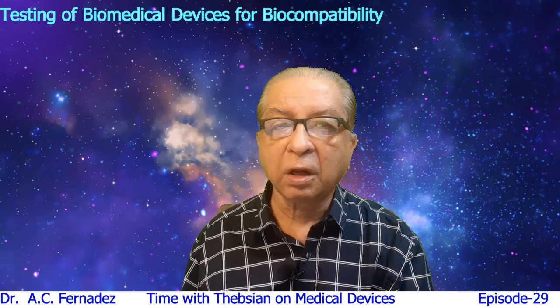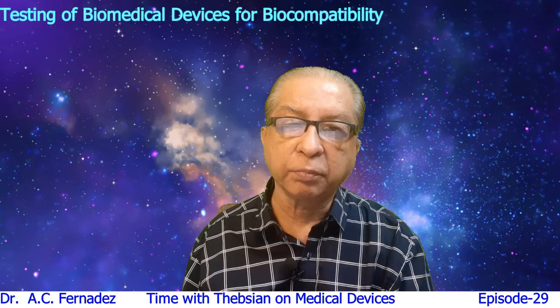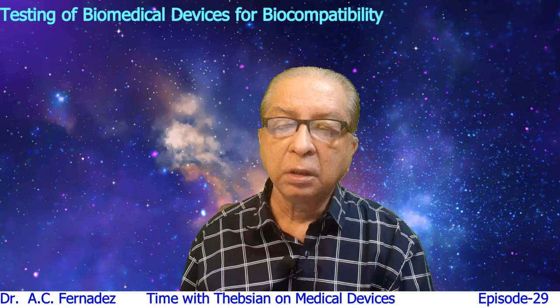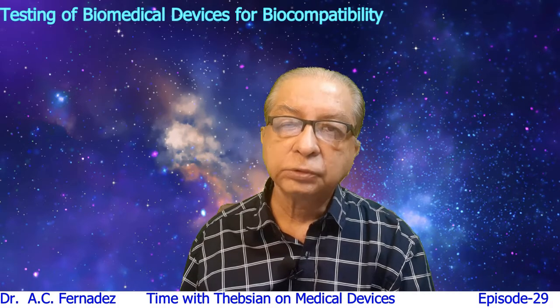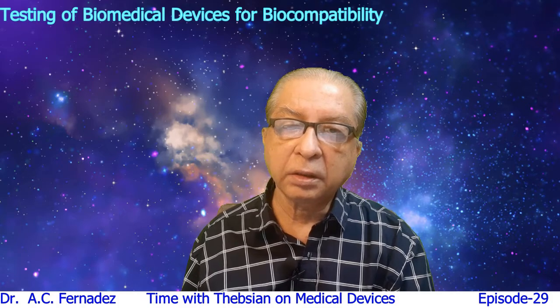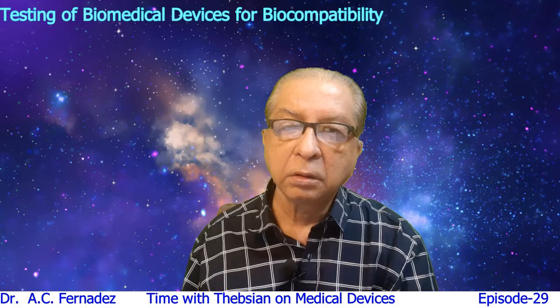So positively, all the manufacturers test their biomaterials and end products for physicochemical analysis.